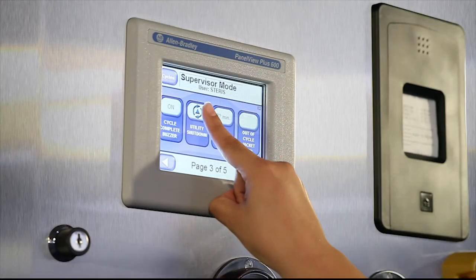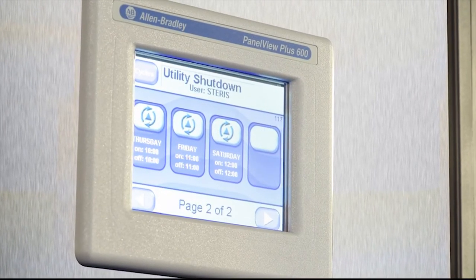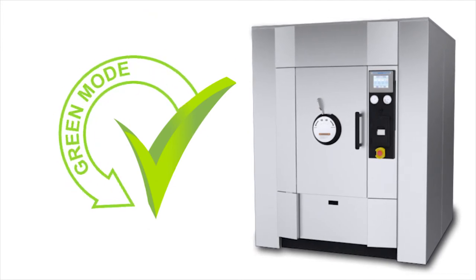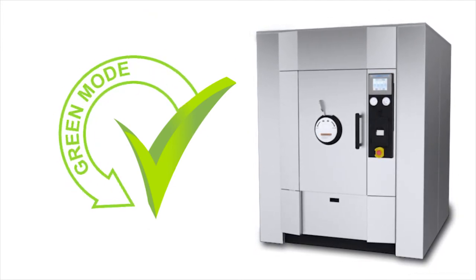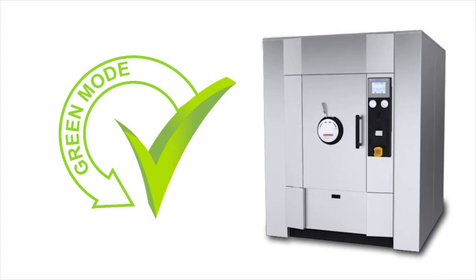The AMSCO Medium LS series can be programmed to automatically start up in the morning and shut down at night for every day of the week. To save additional energy and water, the Green mode allows you to program automatic jacket and generator shutdown during slow times of the day.